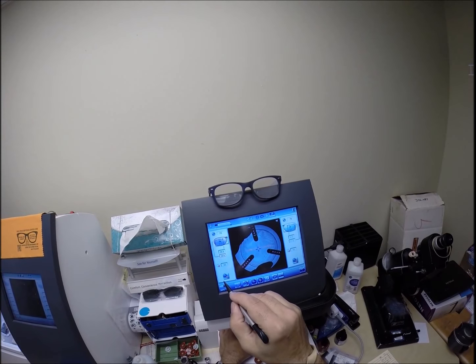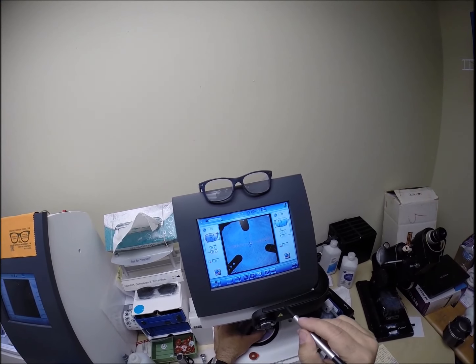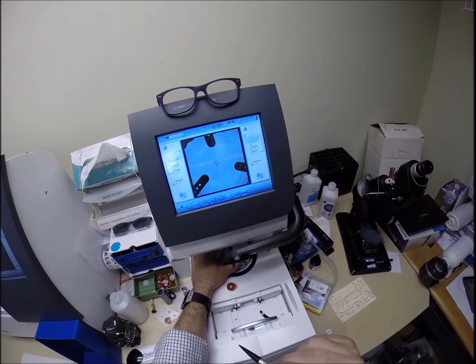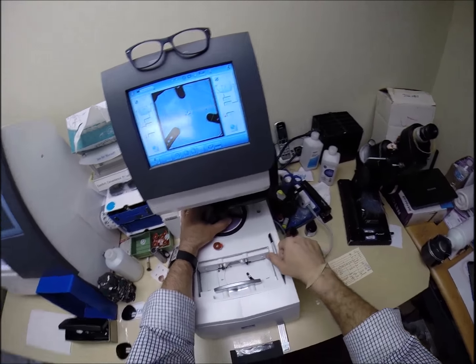Again, I want to check one thing. That's looking good. We're going to keep the optical center height exactly where it is. We're going to hit that button. The arm's going to come down and place a block onto the right lens.